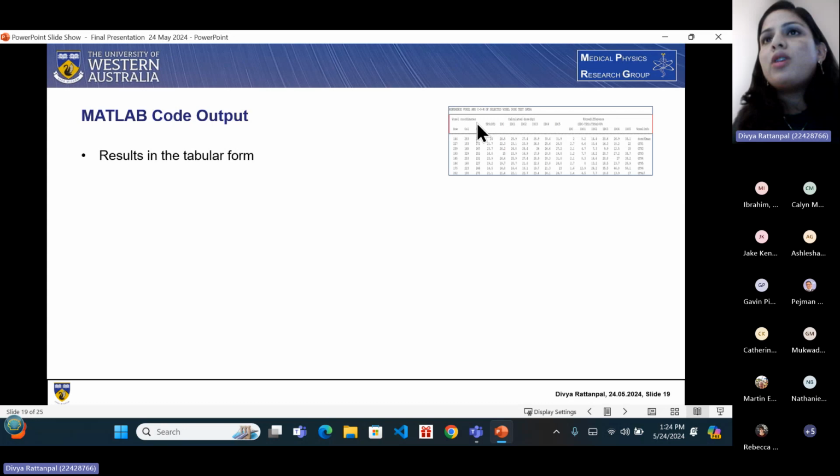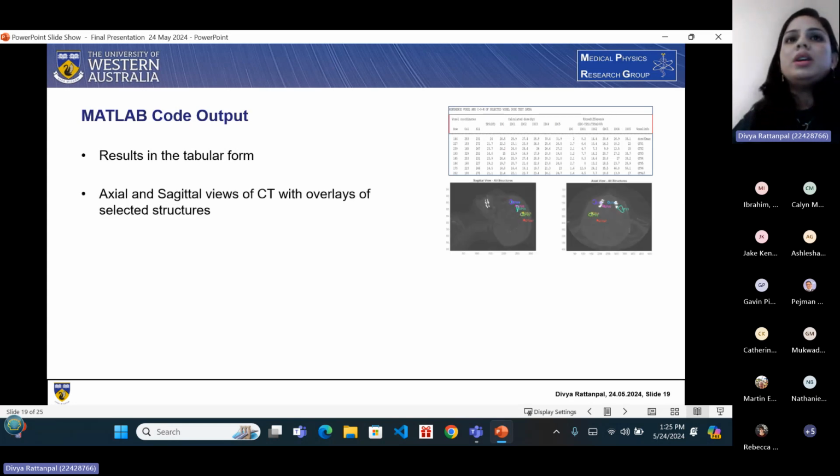It displays the voxel coordinates, the treatment planning system dose, the independent dose calculation using the unmodified off-center ratio data, and 5 dose calculation values using the 5 modified off-center ratio data. Then it displays the percentage dose difference of these calculated doses from the treatment planning system calculated dose.